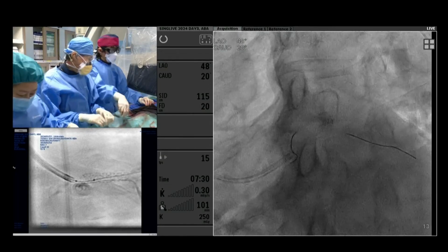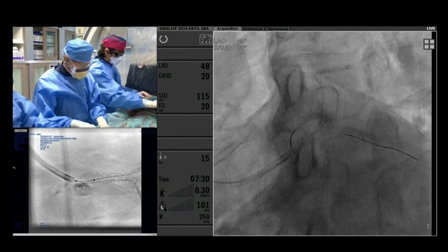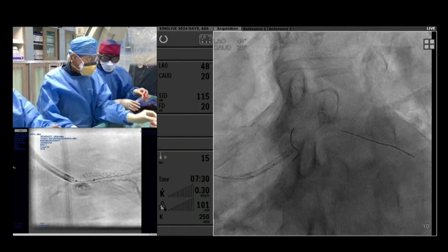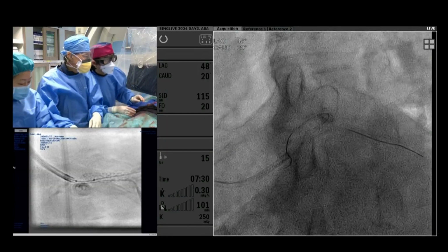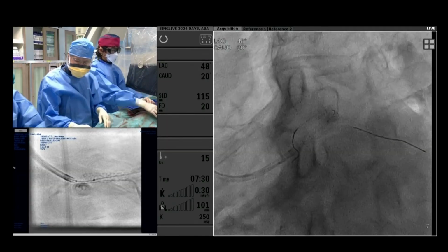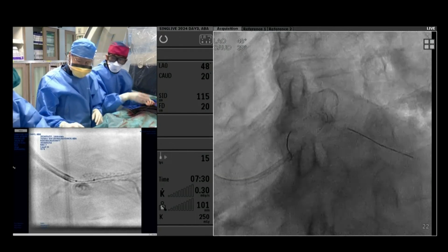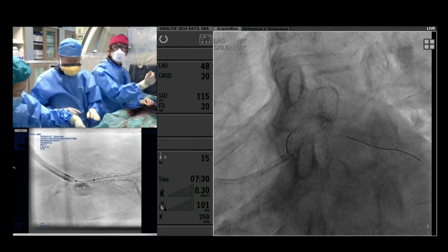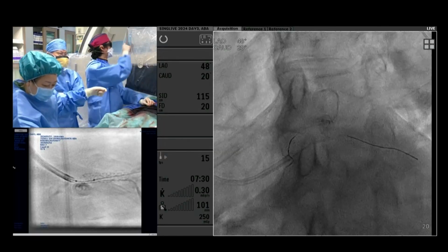Ronald, any experience with a small microcatheter for visualization with contrast? Yeah, but not always. I don't usually do that. I think it's hard to inject enough to visualize, so it doesn't serve well. But sometimes if there's no choice, it might be an option.